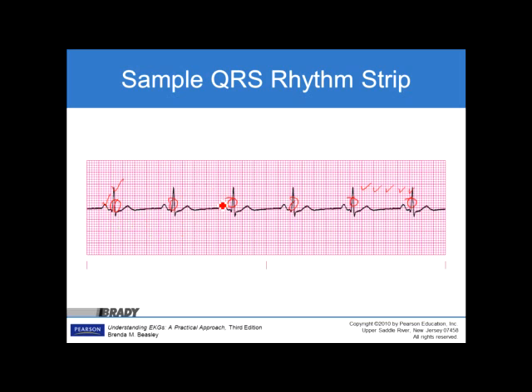The next thing we would do is look at the PR interval. The first deflection, 1, 2, 3, 4. I got a PR interval of 0.16. So that is a normal interval, and it looks like it's keeping that throughout. And I'm going to look at the QRS width here, which is from here to here. So we have about 2 boxes, which is 0.08. So everything so far looks normal in this EKG strip. There are no aberrant findings whatsoever.